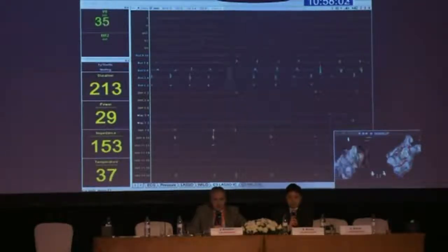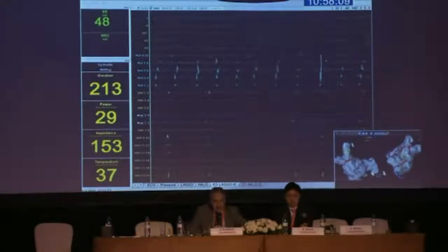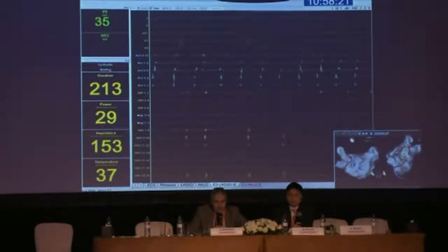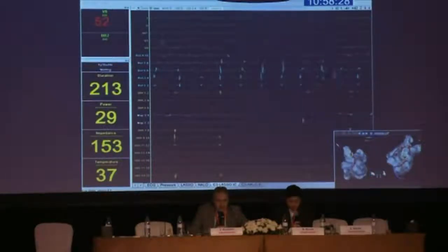So Richard, what are you doing? I see it's slowing down again in the superior vein. Yeah, so we've done what we would think would be a reasonable line. We've slowed it down quite a bit, and now I'm just moving my catheter around the inside of the vein, or the inside of the line, to try and gauge where the weak part of this line is.